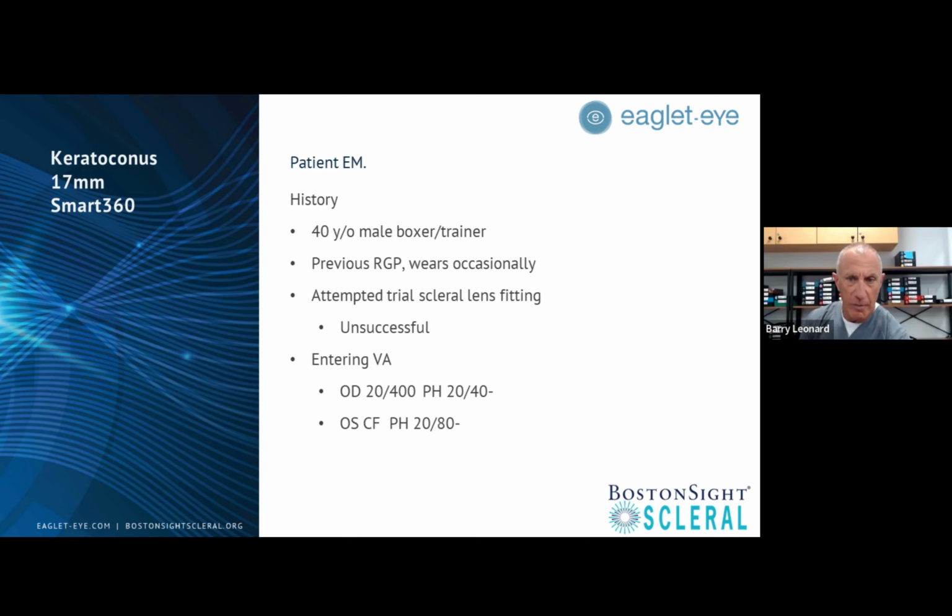I want to go through a little bit of how we make this all work with the Eaglet and the BostonSight FitConnect, using some case studies to show you. And what Chris was saying, the FitConnect is a great tool. You could talk about that for hours, but it's to order and to keep track for myself and my staff, know when warranties are up, all that stuff. It's all there, so don't discount that at all.